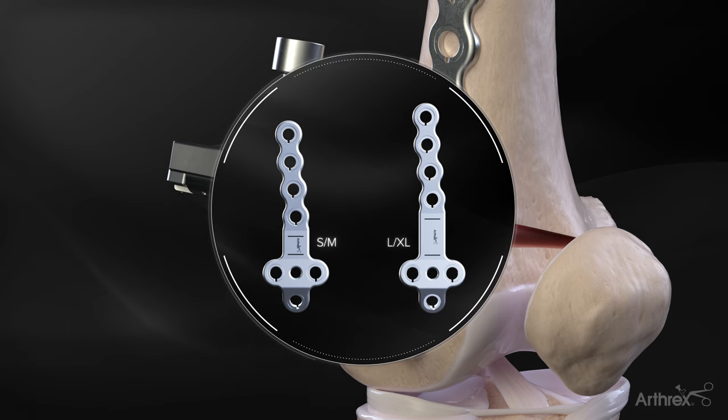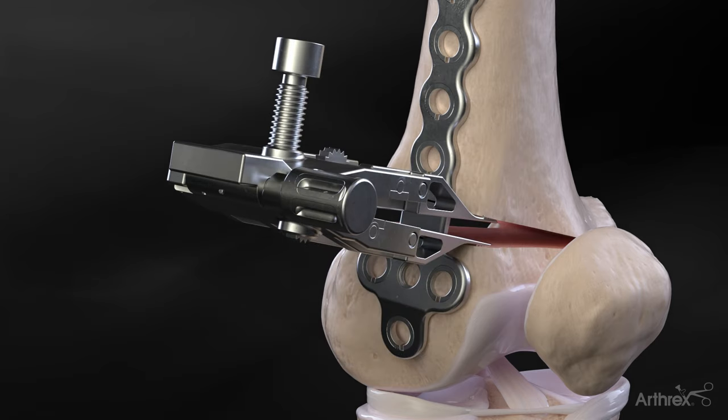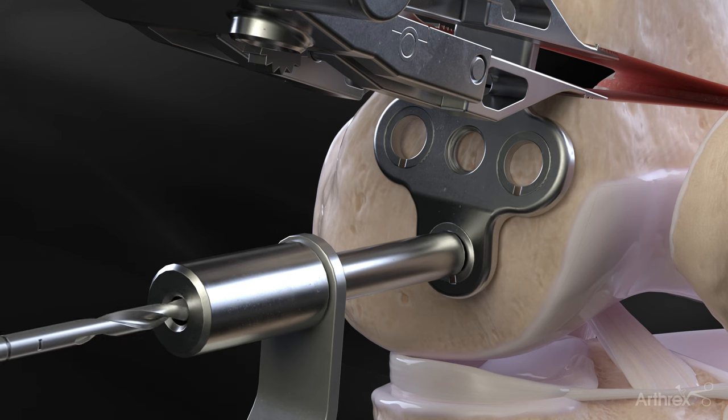Small-medium plates are used for corrections of 0 mm to 10 mm, and large-extra-large for corrections of 10 mm to 20 mm. The spacer is placed securely over the opening created until the plate is flush to the lateral cortex, prior to screw fixation.